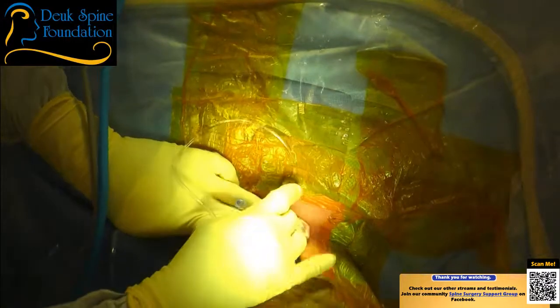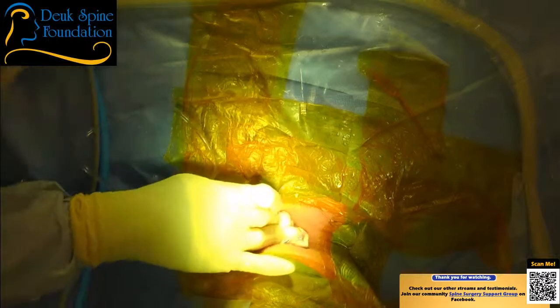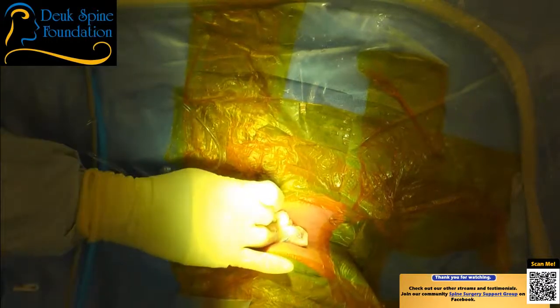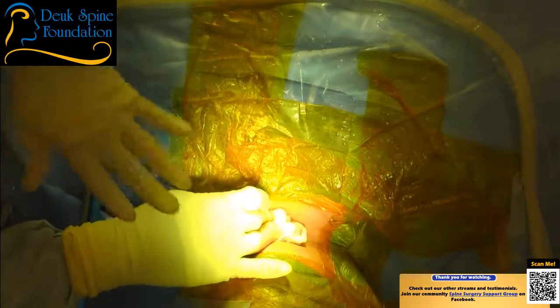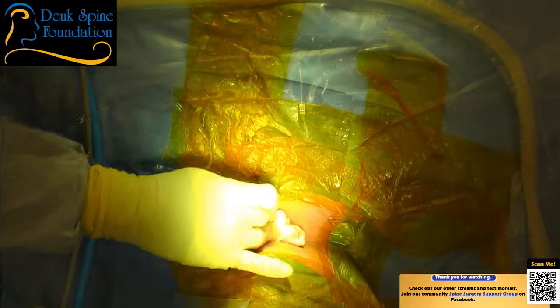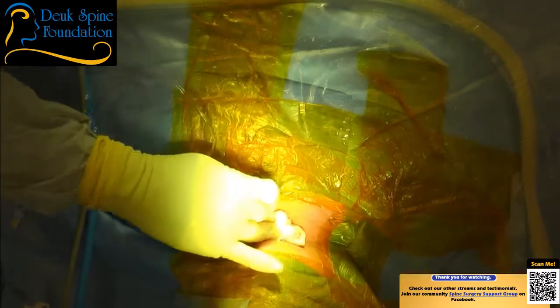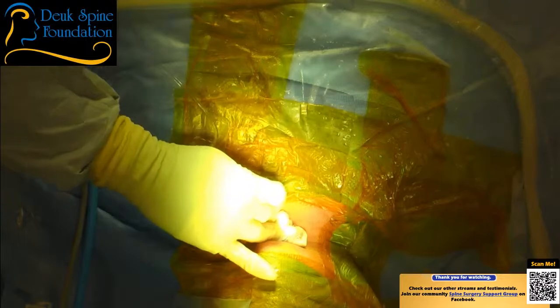Our EBL is 1 mil. We did a right approach. C4-5, C5-6, C6-7 DLDR. By the way, we give our films, the video of the surgery, to our patients. They love getting a copy of that. Take it home, watch it, share it.